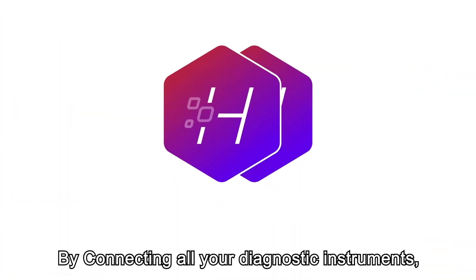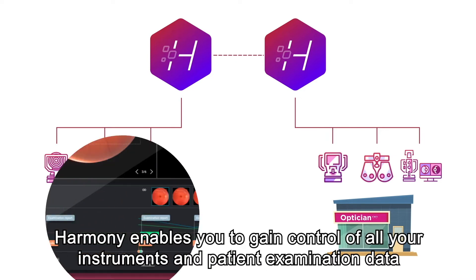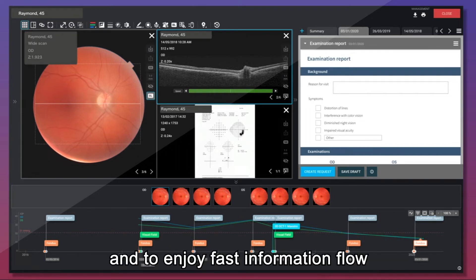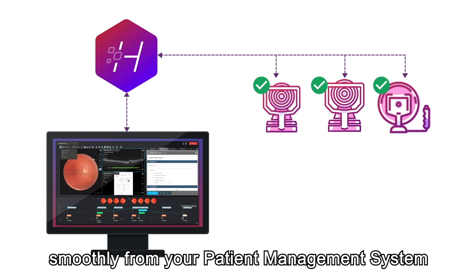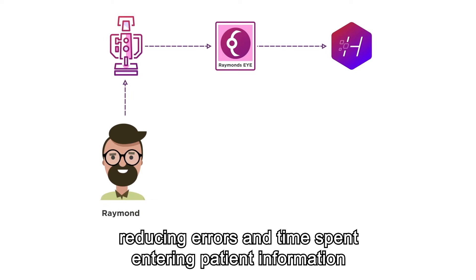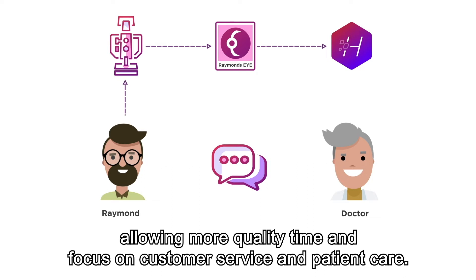By connecting all your diagnostic instruments, regardless of their type and brand, Harmony enables you to gain control of all your instruments and patient examination data, and to enjoy fast information flow smoothly from your patient management system directly to the instruments and back, reducing errors and time spent entering patient information and allowing more quality time and focus on customer service and patient care.